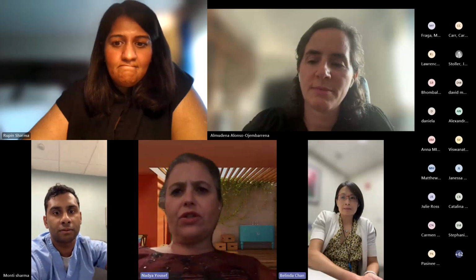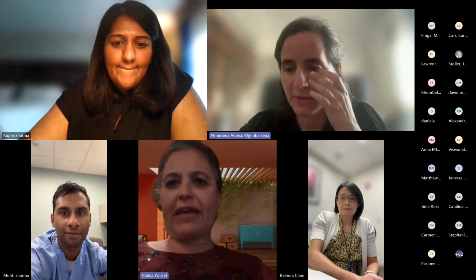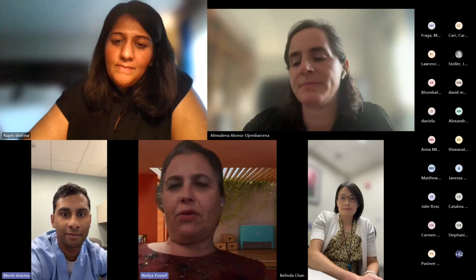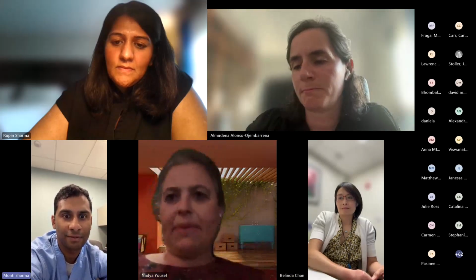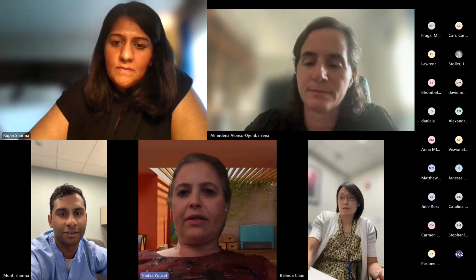Yeah, and I also think it's a question of, sorry, Almudena, go ahead. No, you finish first. It was just completing what Monty was saying. And what we're saying is basically it's also with experience. It's also a kind of pattern recognition. But go ahead, Almudena. Sorry, I interrupted you.